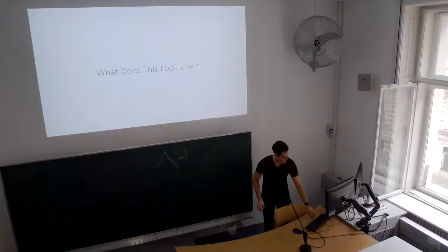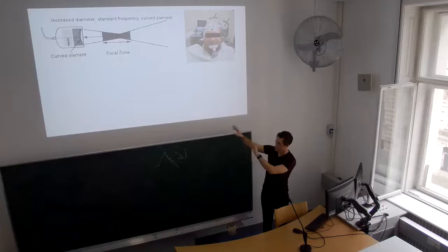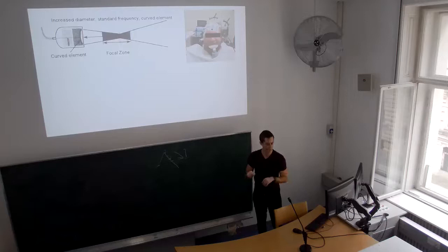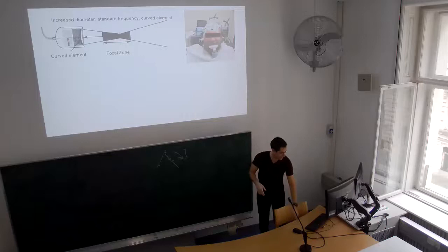Before I start getting into the nitty-gritty details and physics, what does this look like? This gives you some perspective. We have this device, which can look different ways, but it generates ultrasound in a focal point and you affix it to the head somehow. It can't go through air. If it goes through air, it bounces off and attenuates dramatically. So you have to have it aimed precisely and affixed to the head with gel, filling any gap, because it can't go through air.